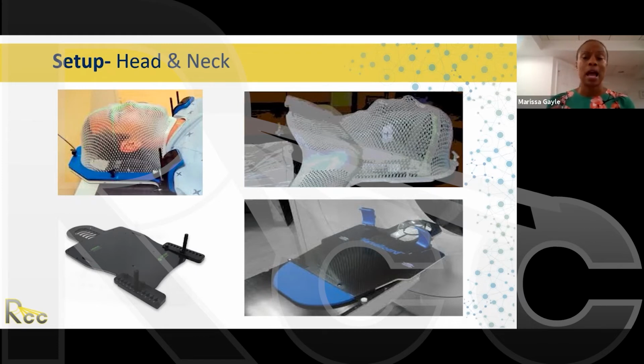On our head and necks, I will mark where the isocenter is, and then I will also give a patient an inferior mark, maybe around the sternum, to ensure that they're in a line, and I'll mark the top of the mask so we know that they're straight left to right.